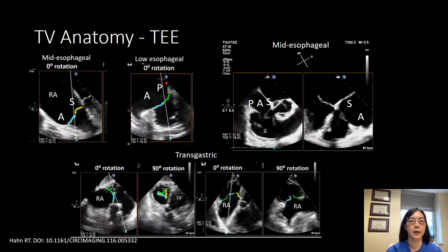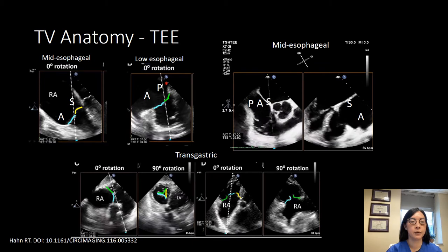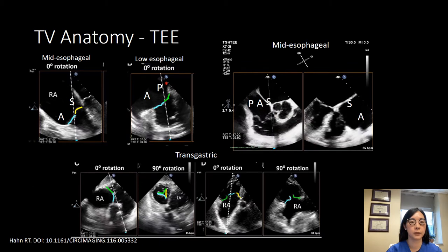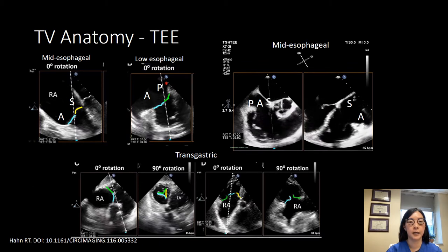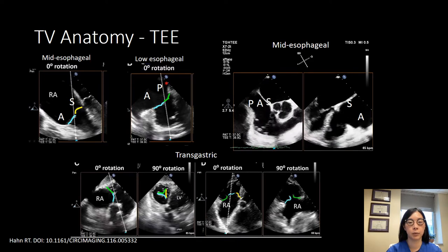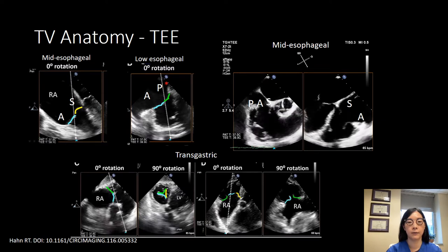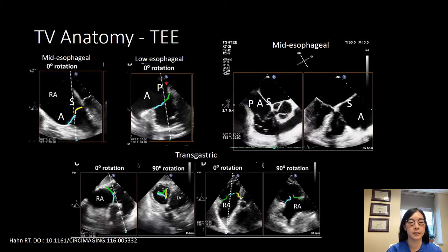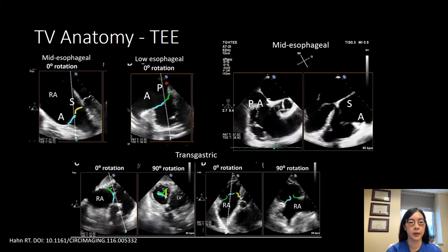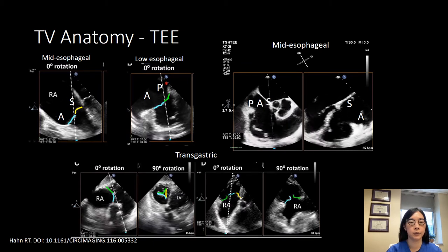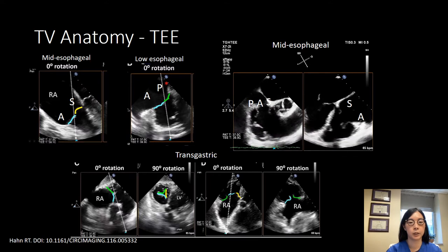To briefly review tricuspid valve anatomy: in a true mid-esophageal view you're usually looking at the septal and anterior leaflets. If you push down and see the coronary sinus, you're looking at the posterior and anterior leaflets. In a short axis mid-esophageal view with three leaflets visible, you're looking at the posterior, anterior, and septal leaflets. In a four-chamber view, you're looking at the septal and anterior leaflets. In the stomach, the septum indicates the septal leaflet, the liver indicates the posterior leaflet, and the remaining is the anterior leaflet.